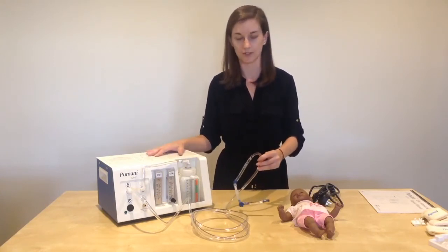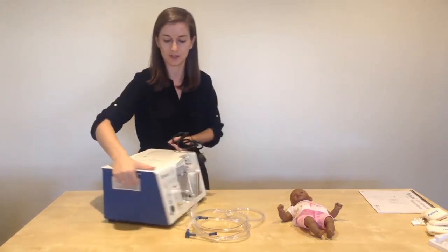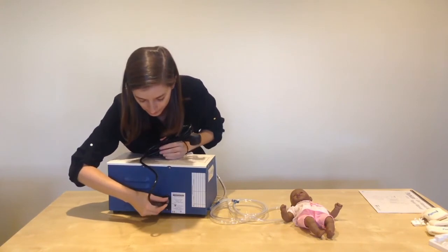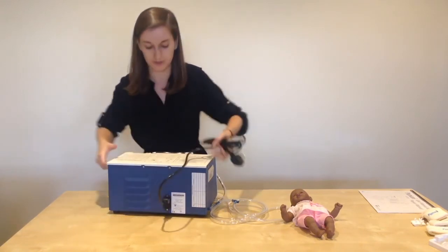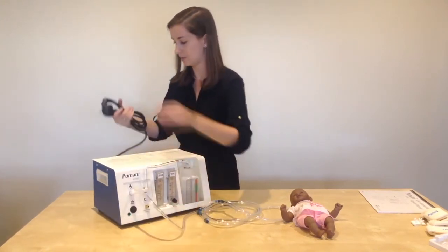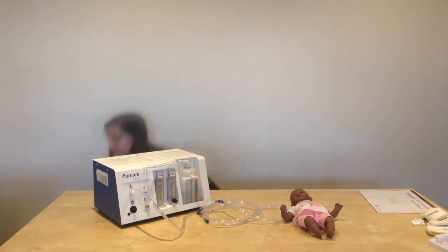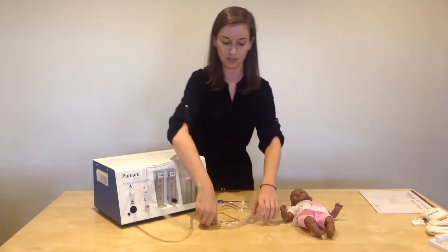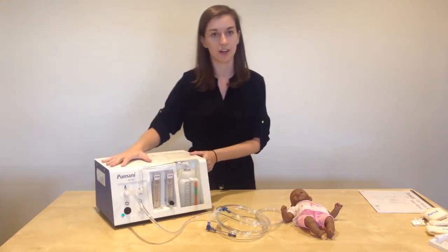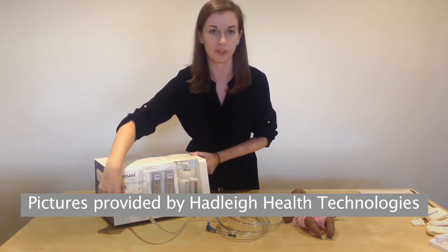The next step is to turn on the device. Take your power cord and plug it into the back of the unit — there is an outlet here. Plug the unit in the back, then plug the cord into the wall. Turn on the Pumani using the power switch. Turn on the unit and you will see a green light lit up when the unit is on.